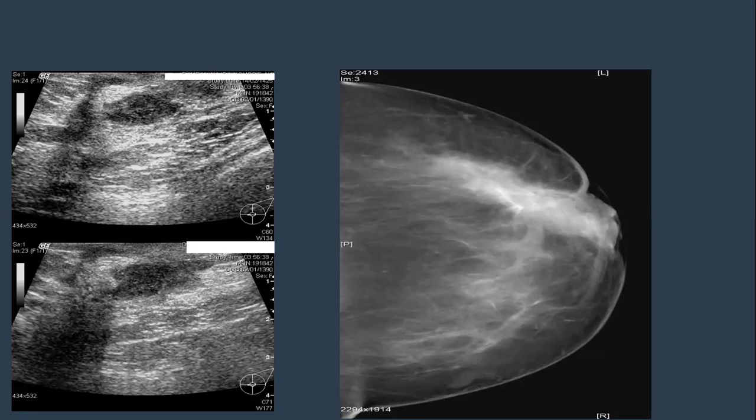It looks like a non-benign or malignant process. And the history? The history of chronicity. Long standing and post discharge looks like a chronic inflammatory process from the skin. The discharge is from the areolar skin, not from the ducts, not from the papilla.